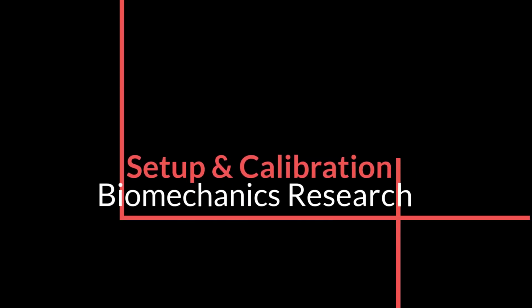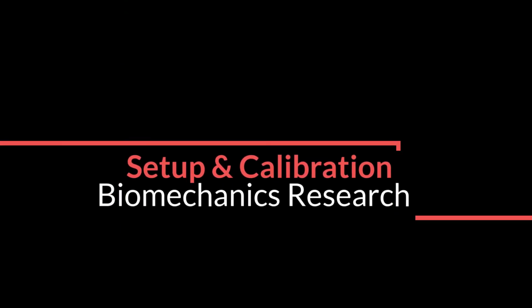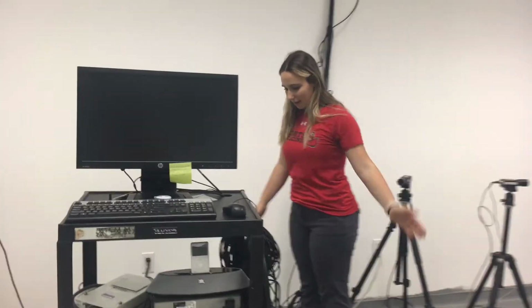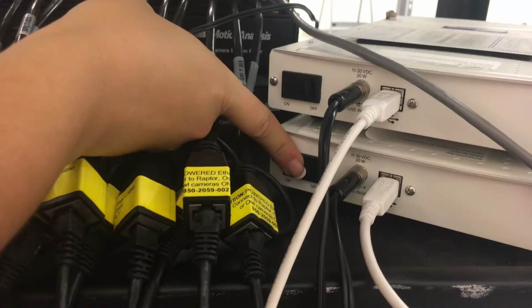Today we will be learning about setup and calibration. The first step is to turn on the computer and cameras. You do this by flipping the switches. Same thing goes for the force plates. There are switches in the back, and then you want to press operate for each.